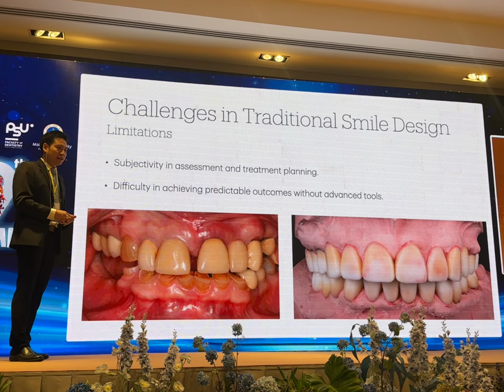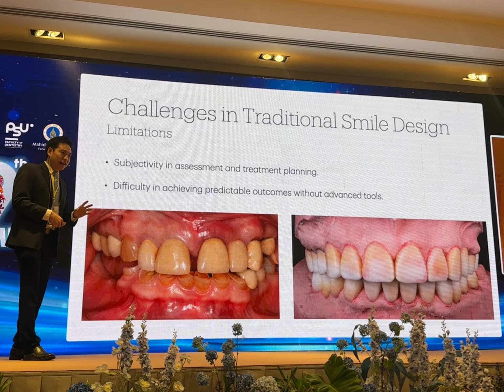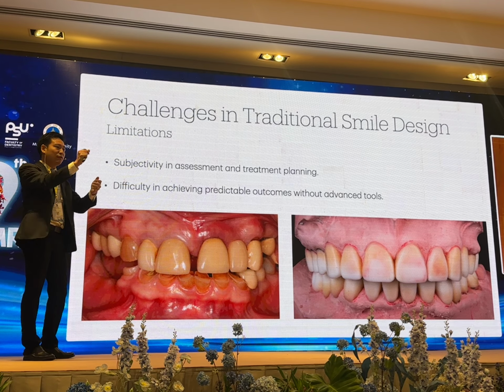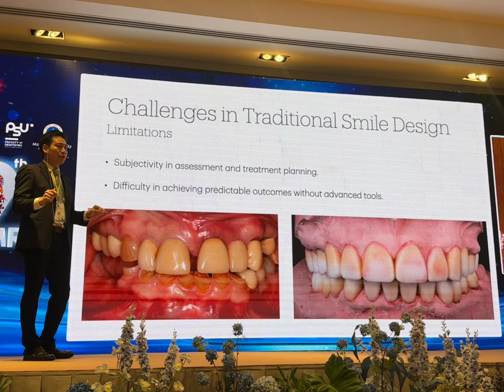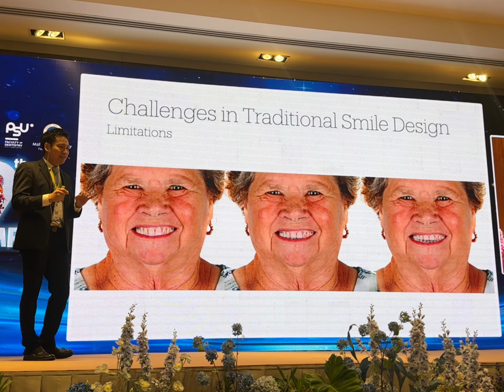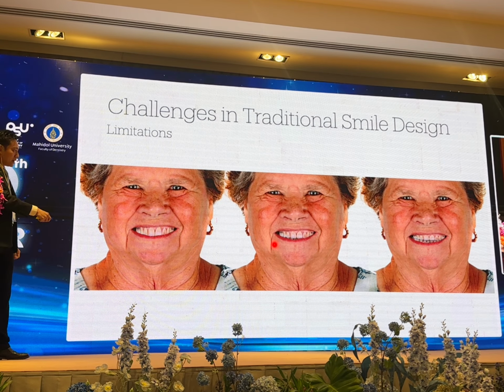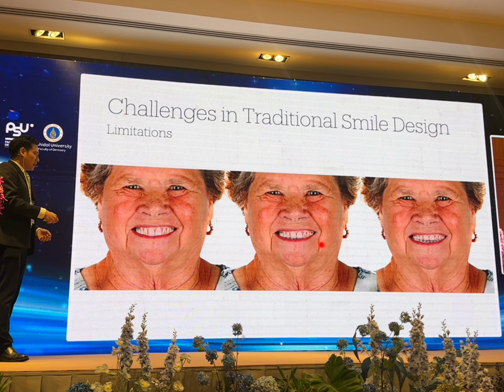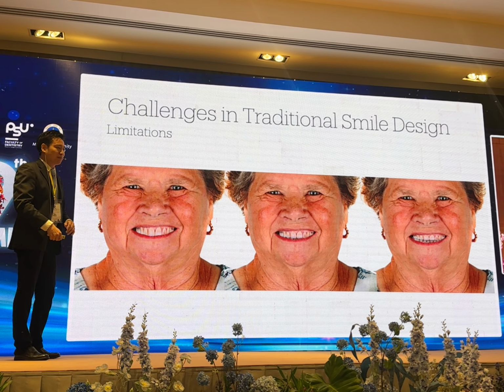But in reality, the teeth of the patient are just a part of their face. When we show the teeth, like in an intraoral photograph, it's like a picture you're drawing or taking. But the lip of the patient is like the frame of the picture. Without the right position in the frame, even if you have really nice teeth, they could be a little too low in comparison with the lower lip, or a little too high and expose too much of the lower teeth. It's very hard to get it right the first time, to put it in the correct position for the patient.